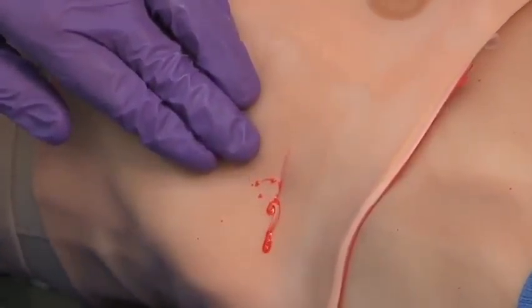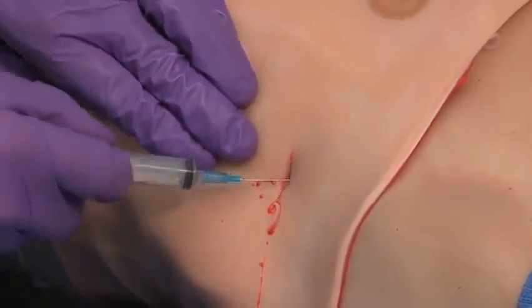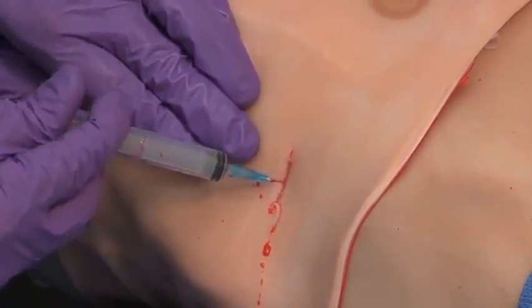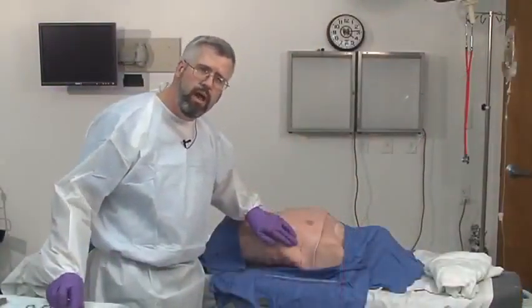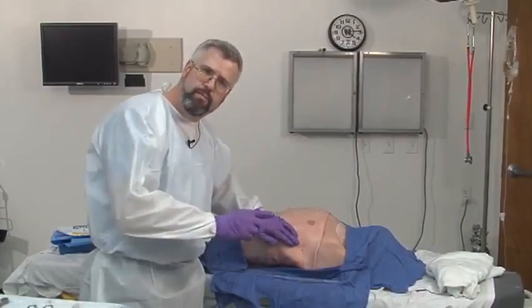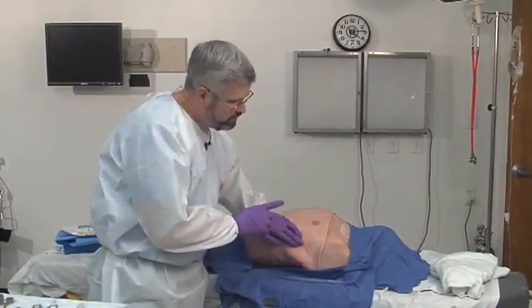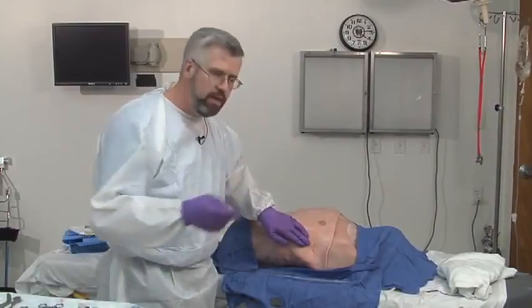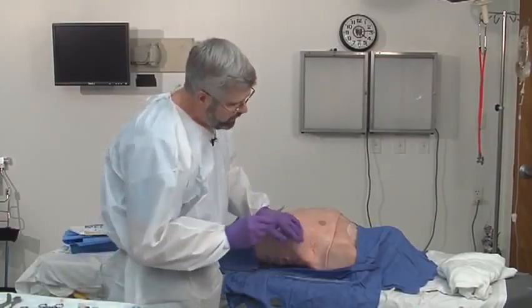I'm then going to take my anesthesia and infiltrate a little bit more anesthesia on top of the rib. The other key point here is you want to go on top of the rib, not under the rib, because the neurovascular bundle is under the rib and you'll cause intercostal bleeding if you do that. The other key here is to use a large clamp.